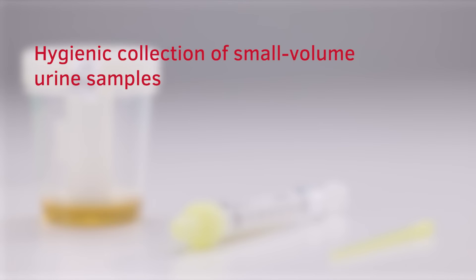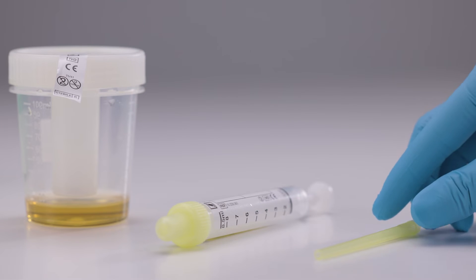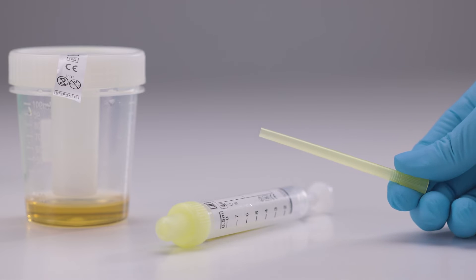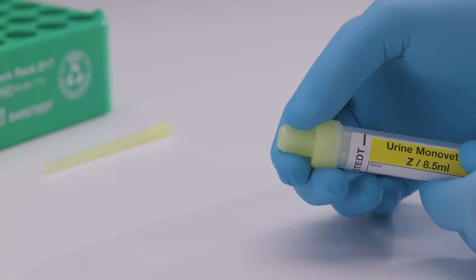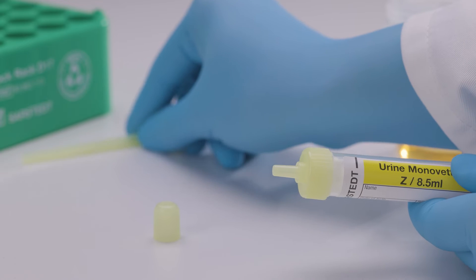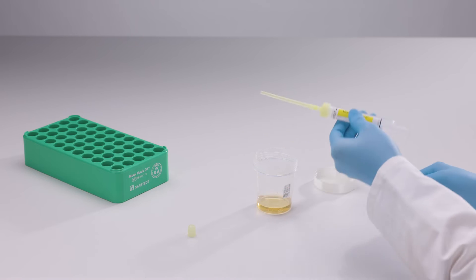Hygienic collection of small volume urine samples. If the sample volume in the NFT cup is very small, collect the sample openly. To do so, you will additionally need a collection tip for the urine MonoVet. Open the NFT cup, remove the stopper from the urine MonoVet and set it aside. Attach the collection tip to the urine MonoVet. Insert the tip of the collection tip into the urine sample.